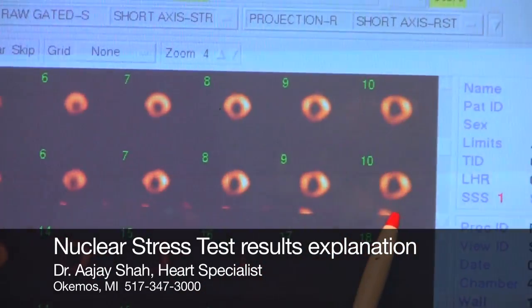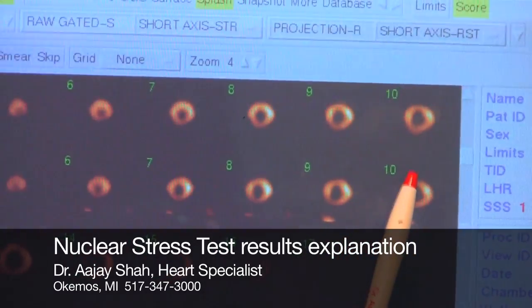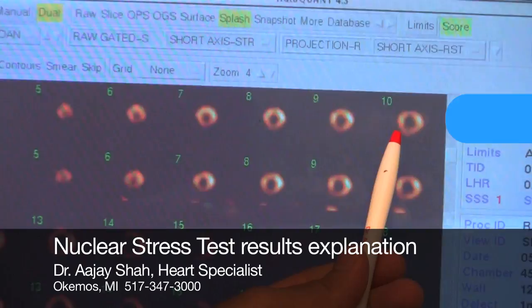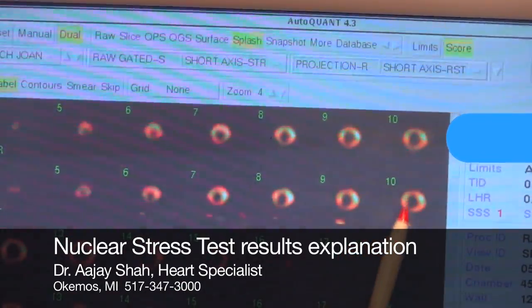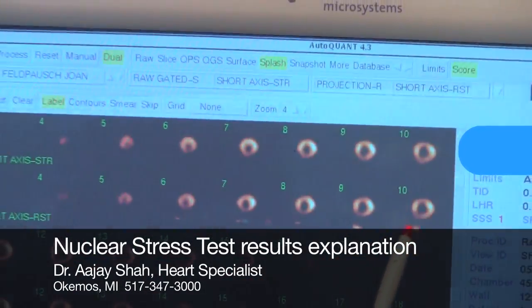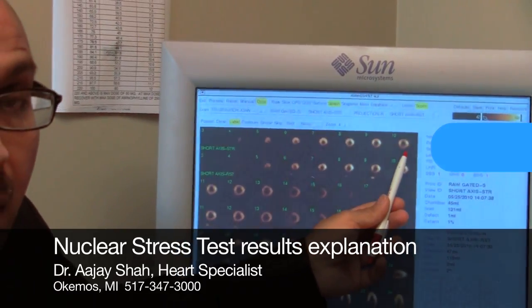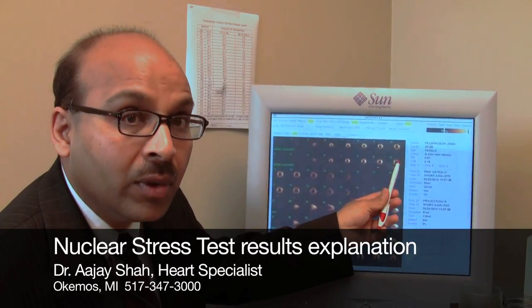You can clearly see that the color or the intensity in this particular person's case is more when the person was stressed and less when the person was resting. That means the heart was able to get more blood while the person is stressed compared to rest — and that's a very normal finding. If a person had a heart blockage, part of this doughnut would be missing, because that area of the heart is not getting enough blood. I'll explain all these details and draw it for you when I sit down with you in person.